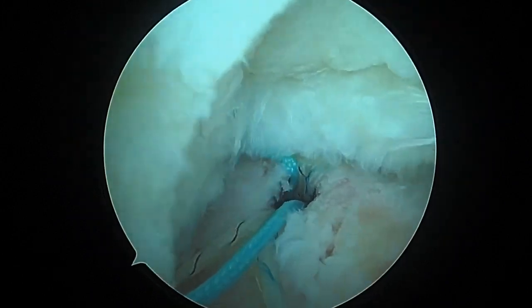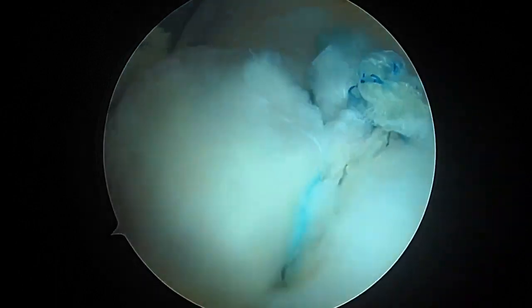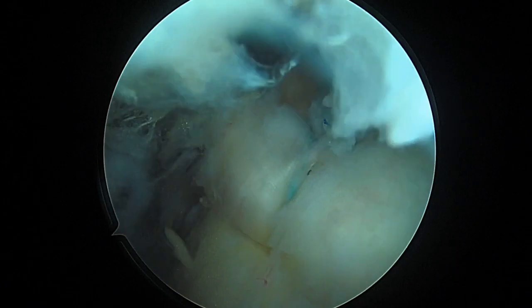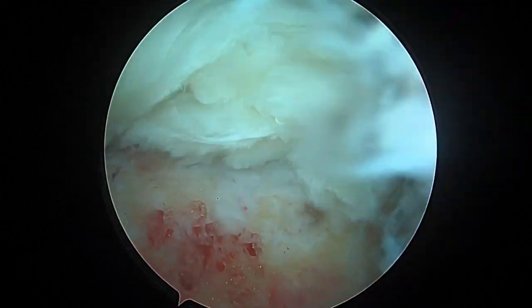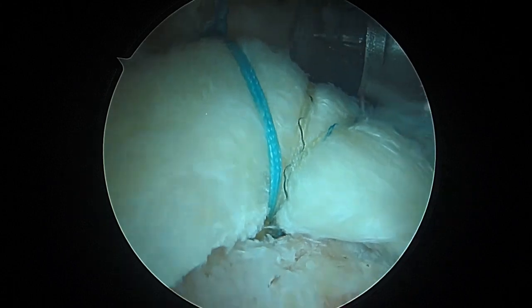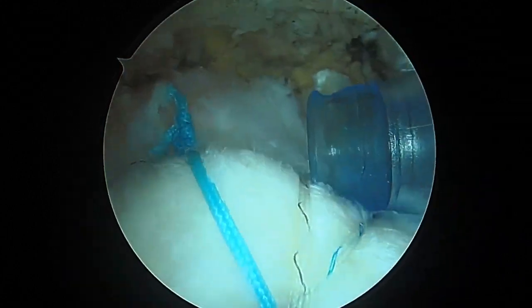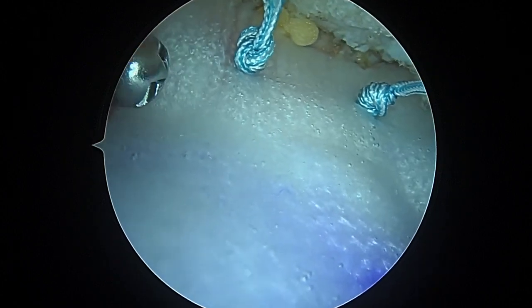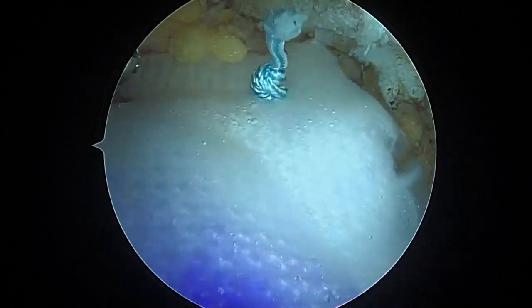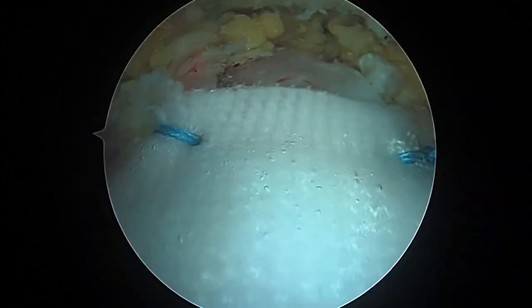Here you can see how we spread out those sutures from the anchor — that's actually a pretty good shot of how those three sutures are spread out like a claw. We've got our sutures from our two anchors passed and tied, so this is a two side-to-side, two triple-loaded repair. That's moving together as a unit; there's still a little bit up here right at the rotator. We're going to reach in from the posterior cannula, grab this here, pull on it, clip off the stick knot, and tie a knot. Okay, so we're all finished here.